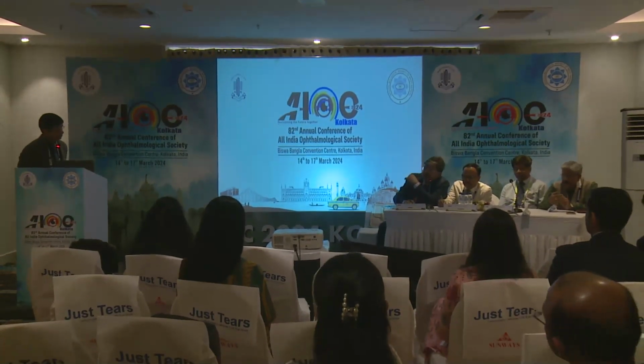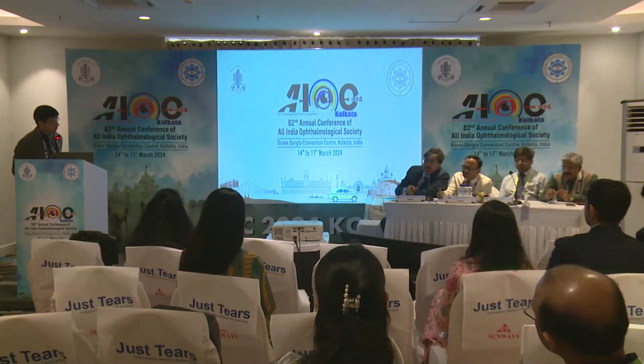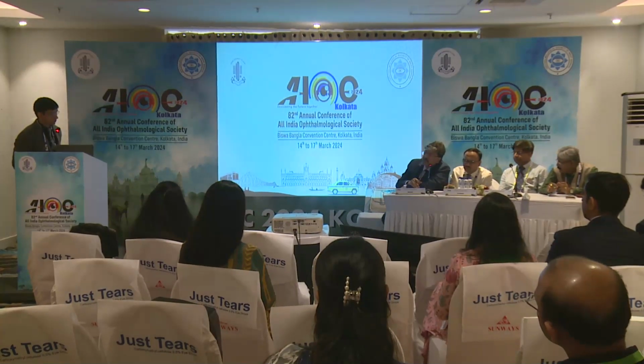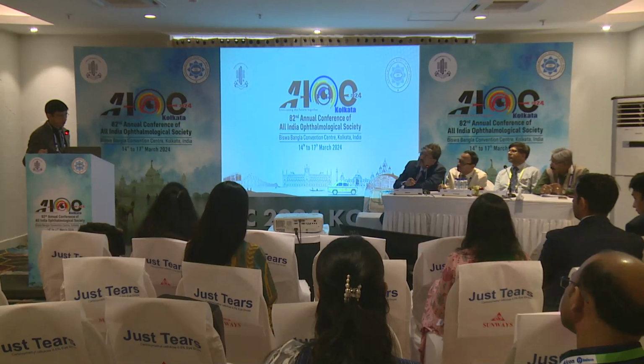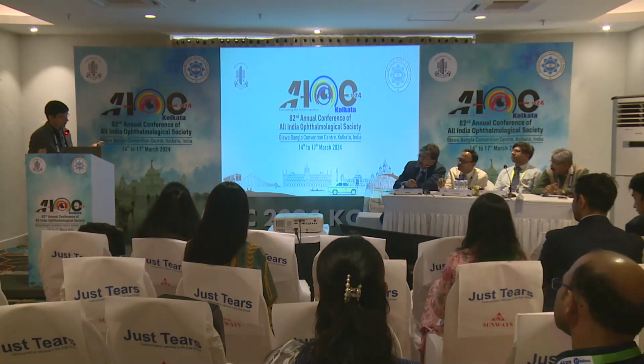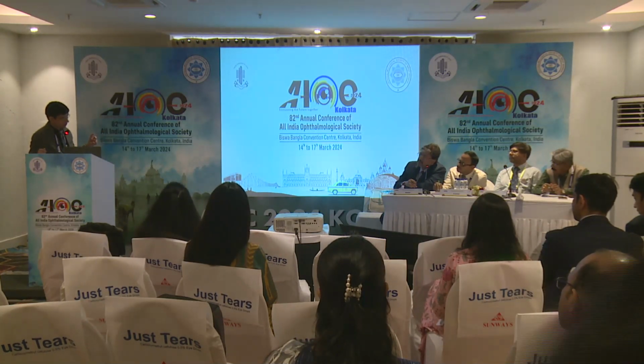Very nicely presented, but my query is, how do you save the lenticule from getting spoiled once you've done the SMILE and taken it out? What's the way of preserving it? What we do is we have a SMILE center at Baroda. I'm operating at Surat. So we transport the lenticules in Optisol medium, the same we use for PK.